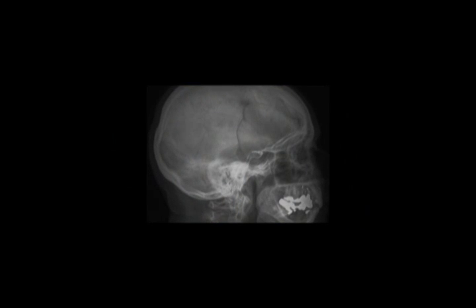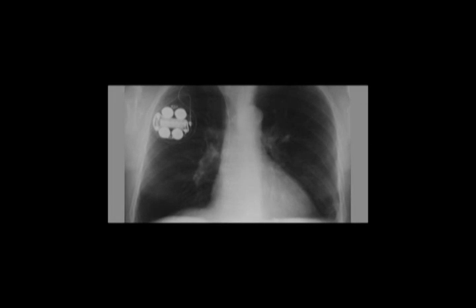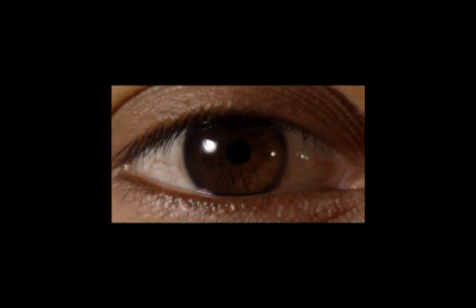Ferromagnetic implants, such as aneurysm clips, and electronically active or passive implants, such as pacemakers and deep brain stimulators, are in principle contraindications for MR scanning. There is also a risk in scanning patients who may have embedded metal fragments in or near the eye. Machine tool operators, metal workers, and welders should be given an X-ray examination to detect the presence of any metal particles.